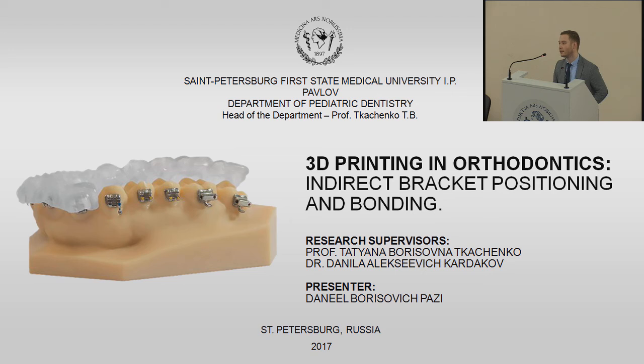Which types of these optimized systems of brackets do you know? What type of bracket system are we using? Because you're talking about this pre-printing and indirect bonding, you can actually use whatever bracket system, for example the Damon system or any kind of Victory system or Mini Diamond and so on. That's up to you. Choosing a bracket system is more related to your diagnostics and so on. It's not about the method you're bonding it. So there are no disadvantages to this method in choosing the bracket system you want.